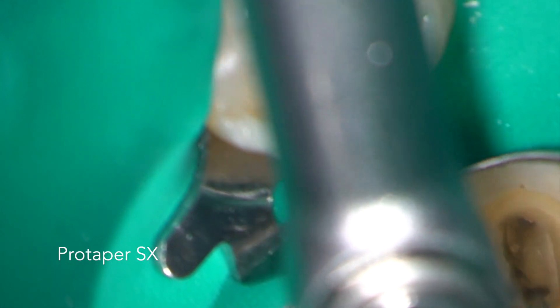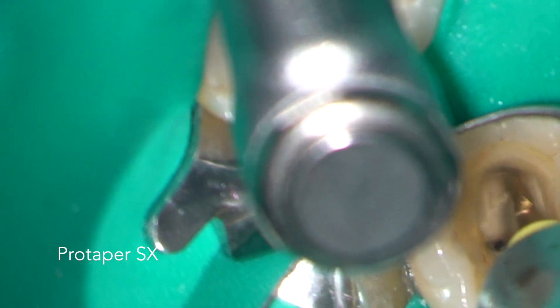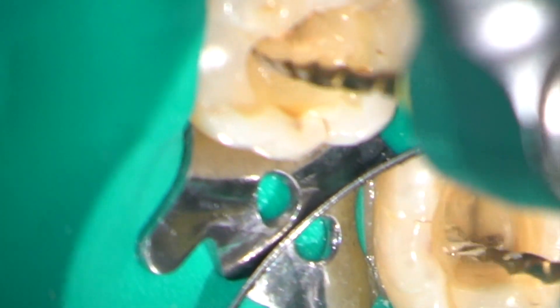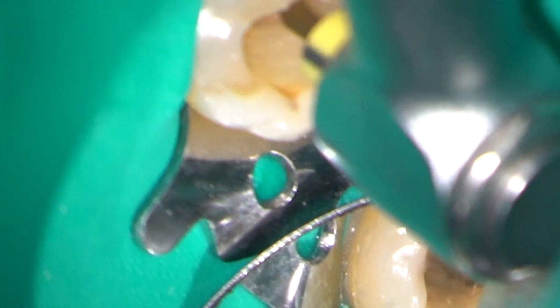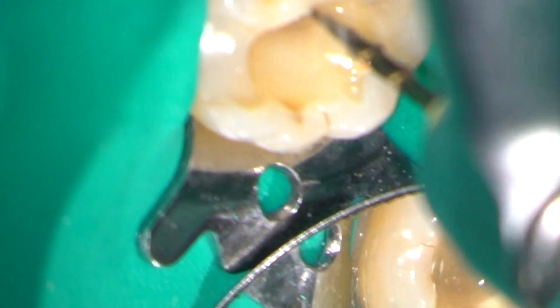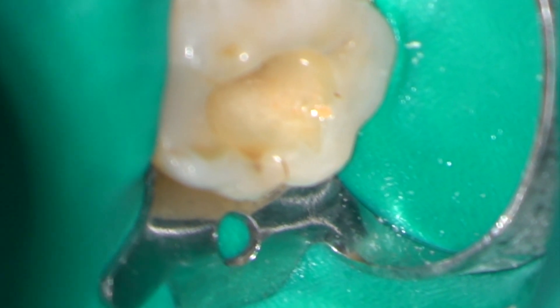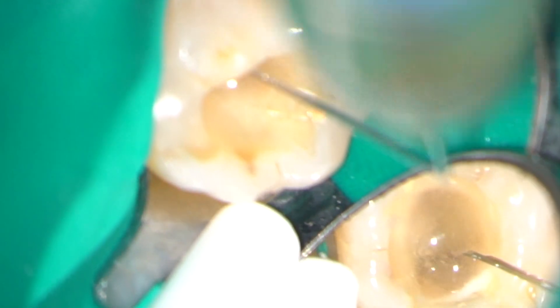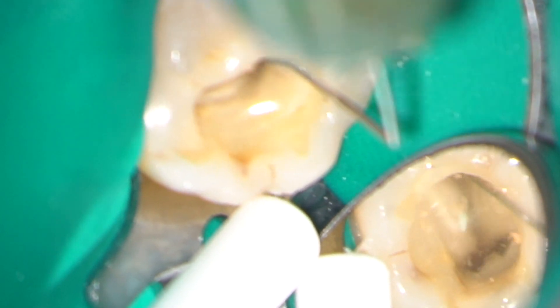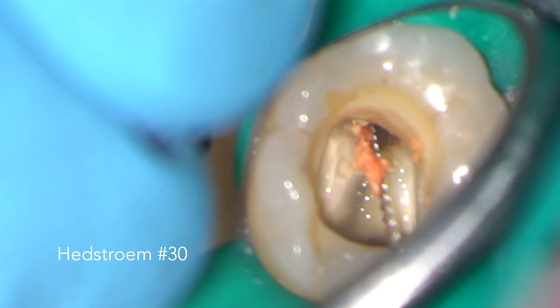Gutta-percha was rapidly removed using a Gates Glidden number 2 and a Hedstrom size 30 to flare the coronal aspect of all root canals. Irrigation was carried out throughout the procedure using 3% sodium hypochlorite. A Hedstrom file is an excellent instrument for removing tags of GP.